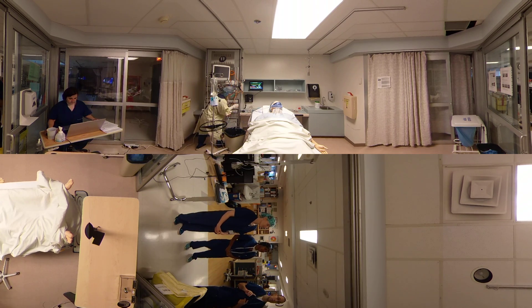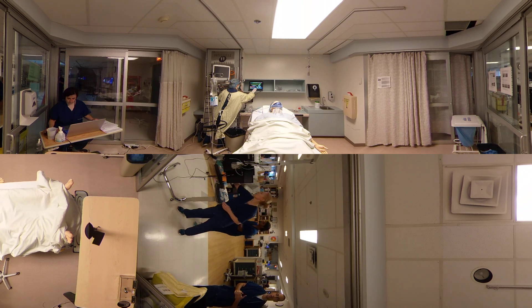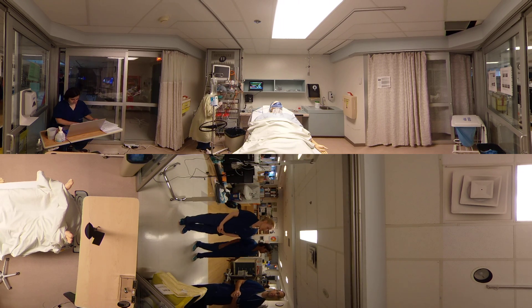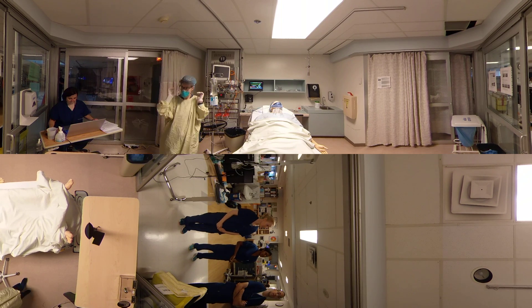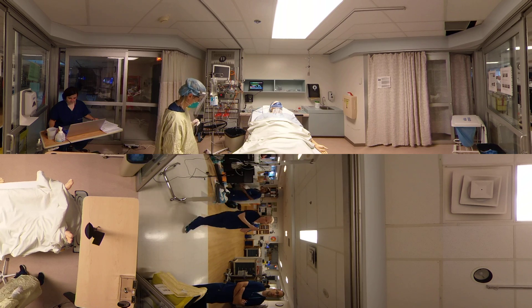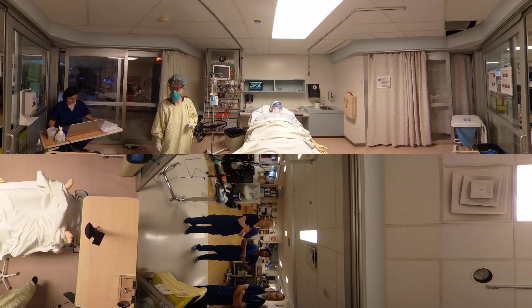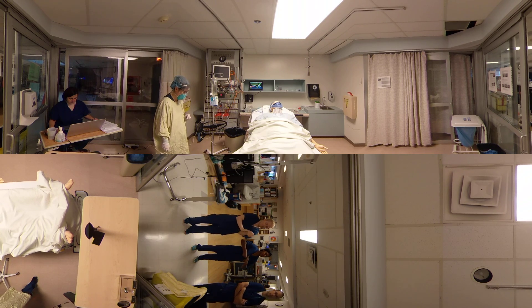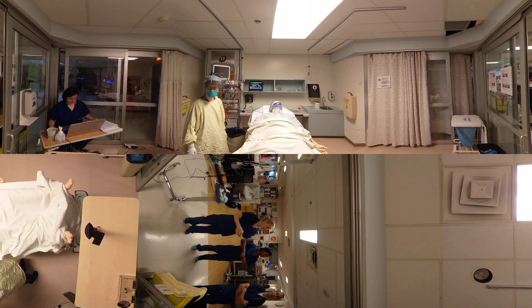First, remove all jewellery: rings, watch, ID, stethoscope, pagers, cell phone, cloth hats. Next step is have hair tied back and secure. Next step is hand hygiene — a 15-second hand rub with alcohol-based hand rub. Ensure the entire surface of the hands are touched, in between the web of fingers, over thumbs and wrists. And when you are done, you're going to don a yellow gown.